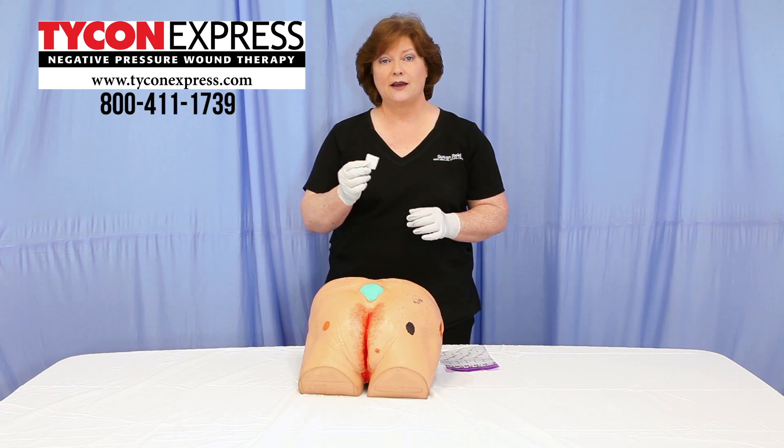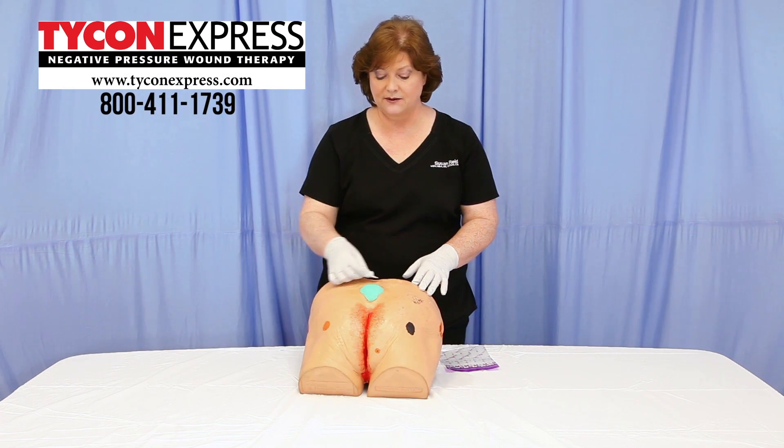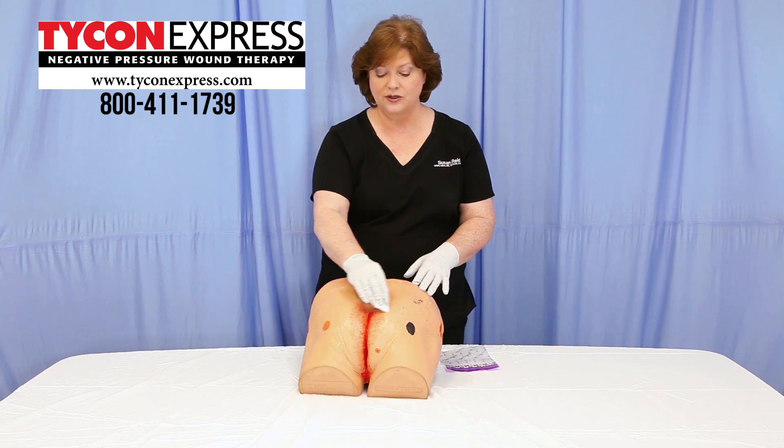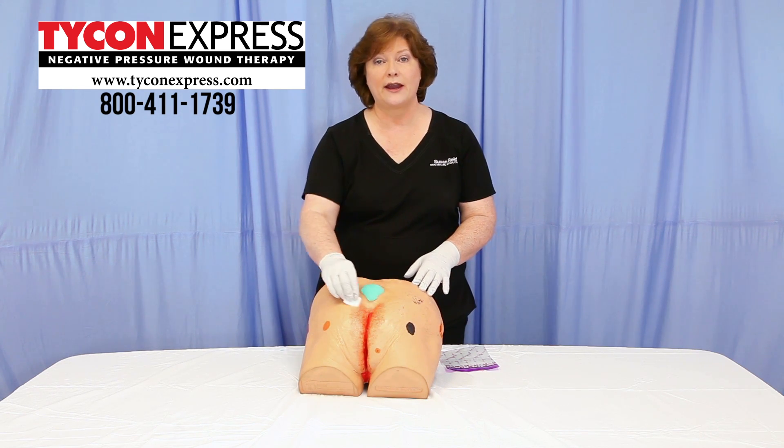Take a skin barrier prep and remove any excessive moisture or anything surrounding the skin. Apply a good thick layer underneath.